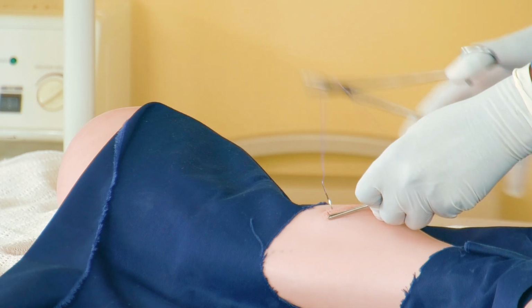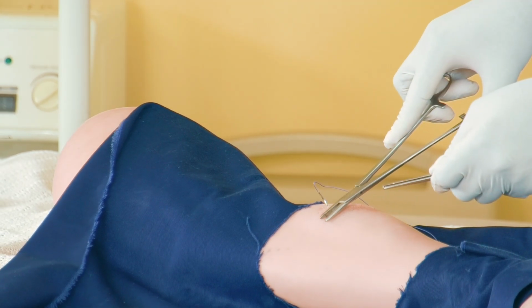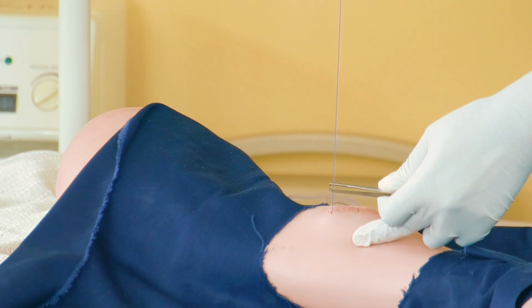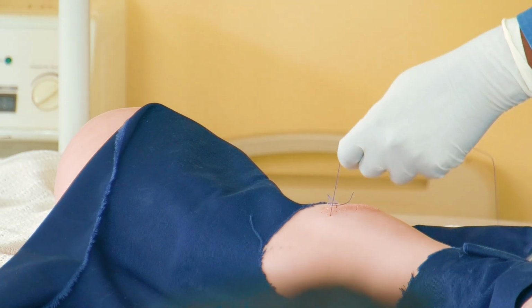I think how to remove also, I think that's another skill. We'll just talk about it. This cannot lift since this is tough. We are using a mannequin. Pull, go up like that. Then you can hold here. See what is happening here.